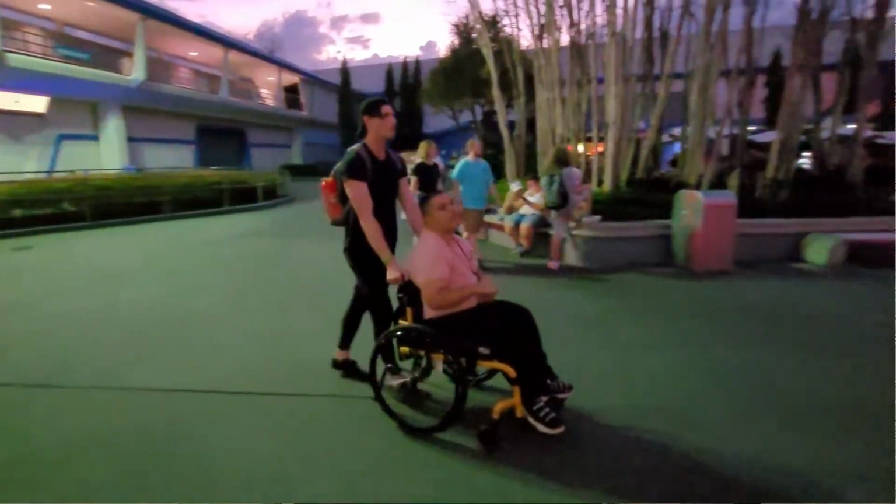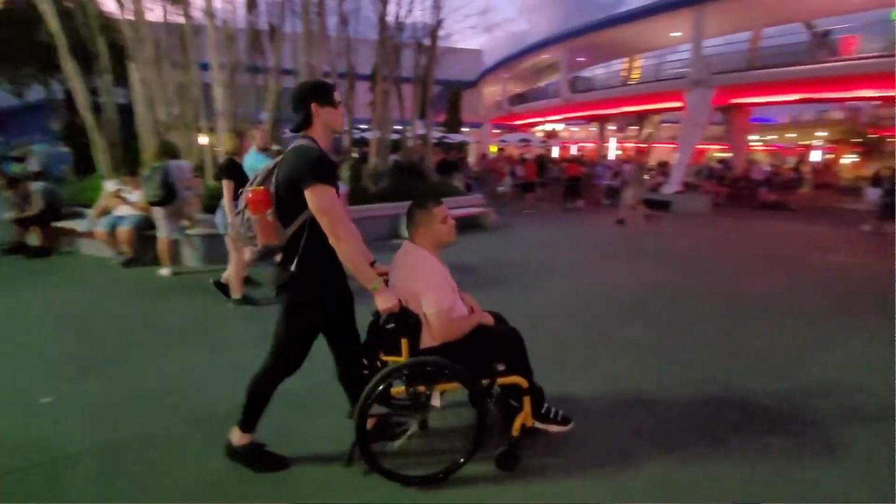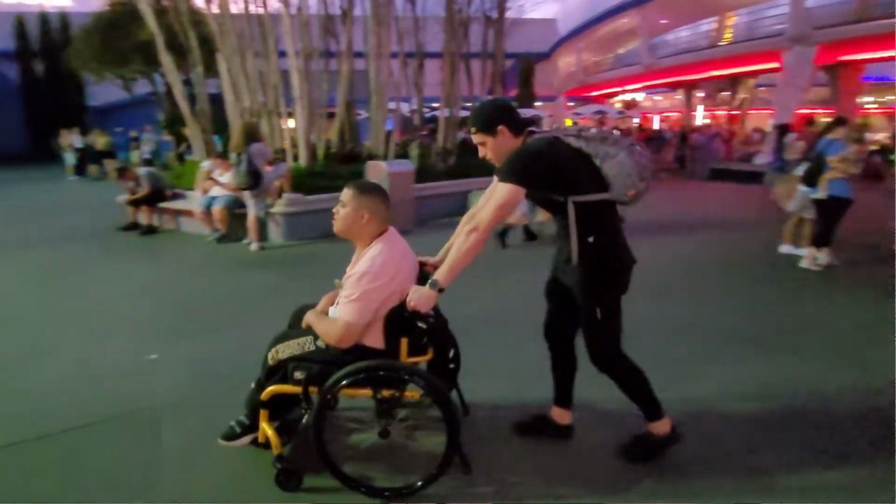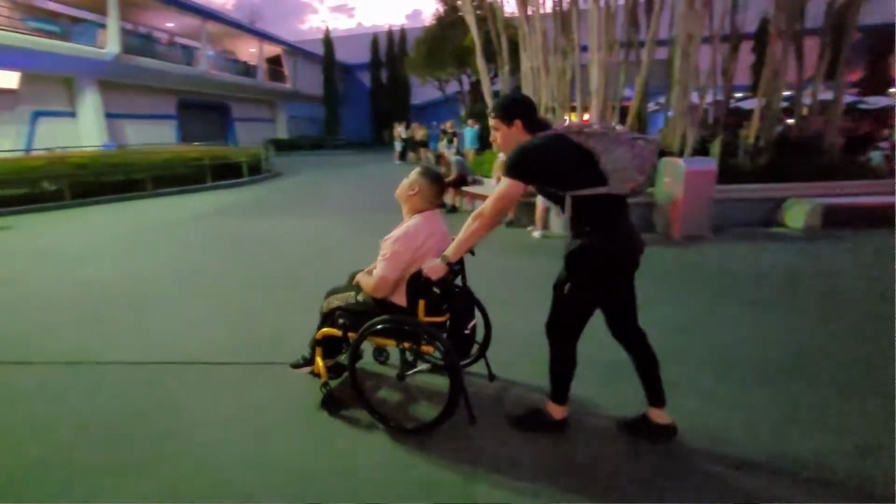So without further ado, the first one would be make sure you're maintaining proper posture when you're walking on level ground, right? So we're going to start on level ground, and the main way that you should do this is staying as upright as you can and just walking how you normally would. Shoulders relaxed by your side, hands gripping, obviously, the handles of the wheelchair. And make sure you're not hunching over, because when we hunch over, it puts a lot of stress on the shoulder joints and you can actually start to feel all of this get really sore by the end of the day.